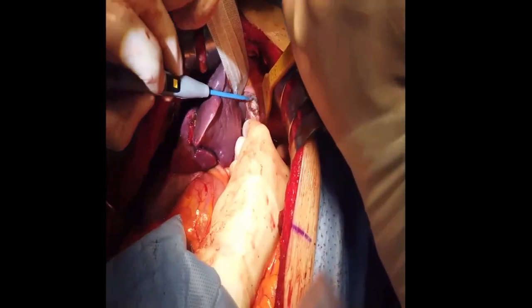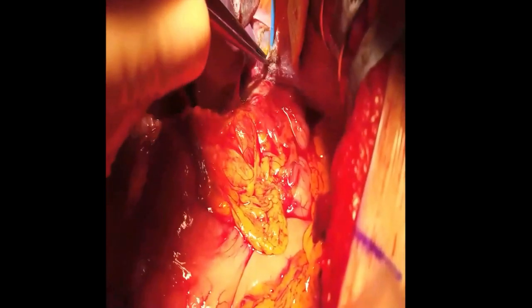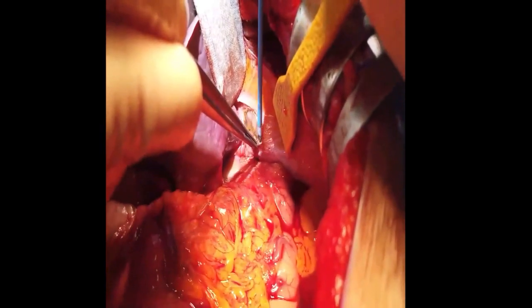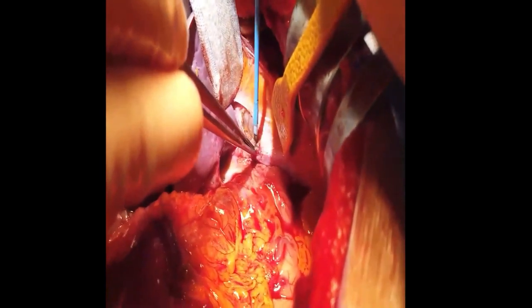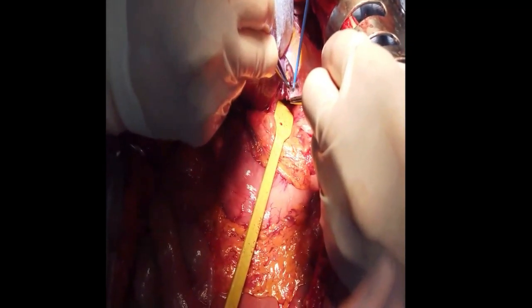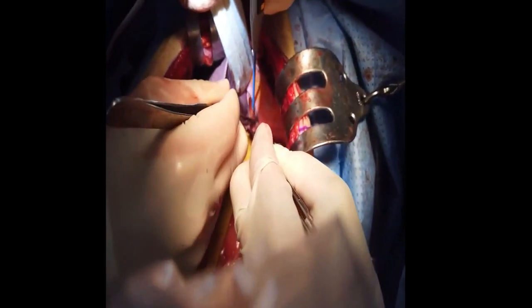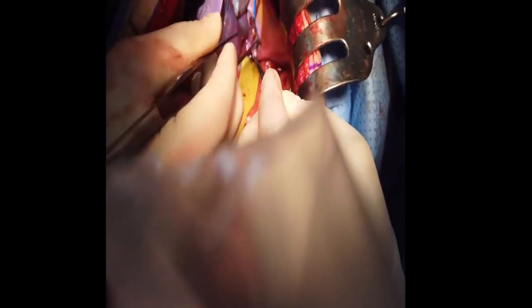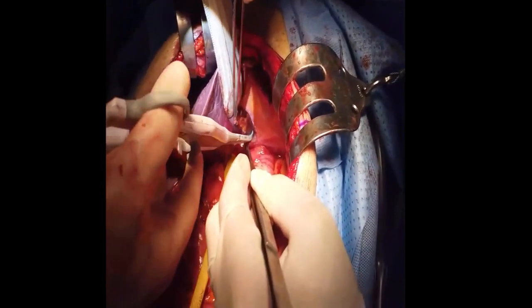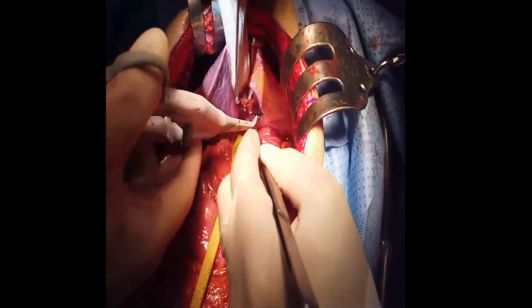We should be careful to avoid pericardial injury during the lymph node dissection because this area is very narrow and dangerous due to the adjacent beating heart. Liver retraction, gastric depressing, and proper widening of the diaphragm incision are needed to obtain a better surgical field. Electrocautery and energy device should be used very carefully not to cause thermal injury.